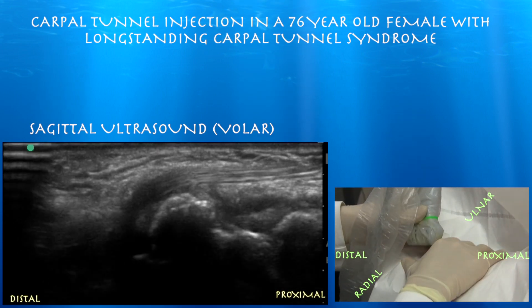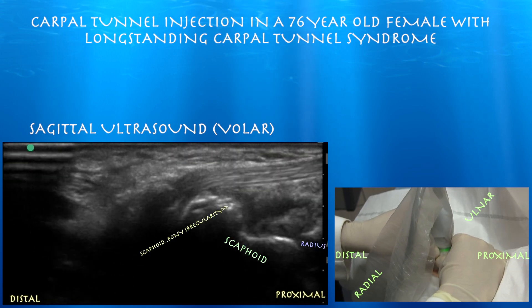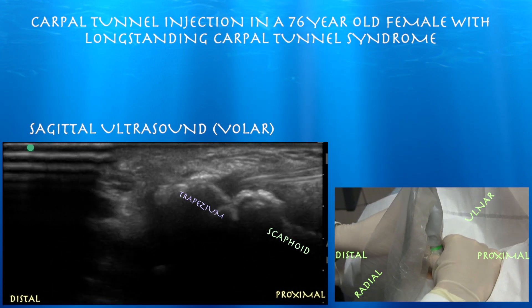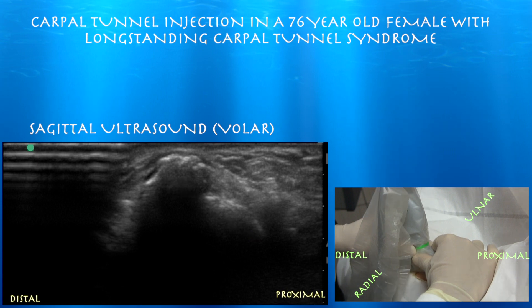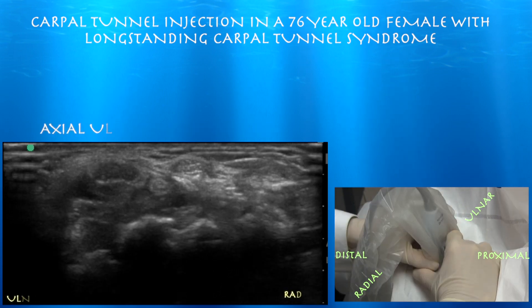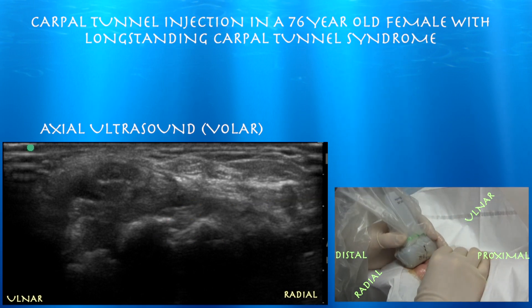We can also look at the contour of the scaphoid bone. Here we have the distal radius and the scaphoid in a typical peanut shape, with some irregularity at the distal pole of the scaphoid. Now going into the scaphoid-trapezium articulation, and then the trapezium-first metacarpal joint — the base of the first metacarpal against the trapezium, which is very often arthritic. You can see irregularity of the bone consistent with arthritic changes. Here is the articulation of the lunate and scaphoid with the palmar scapholunate ligament.